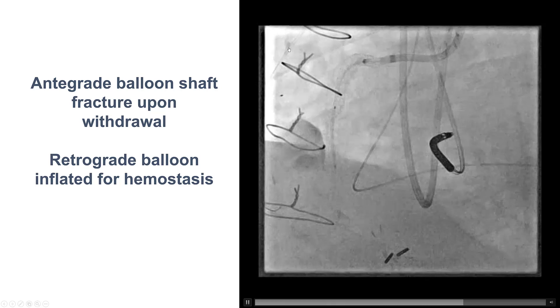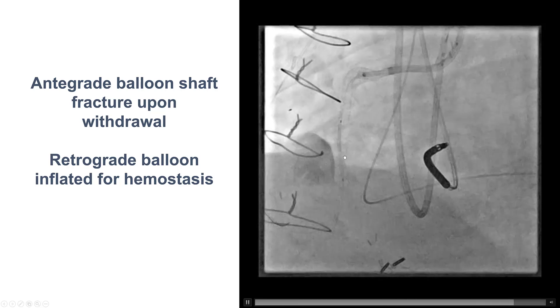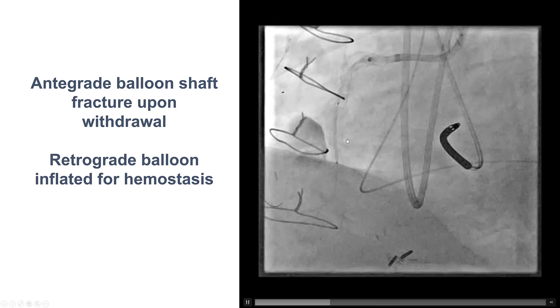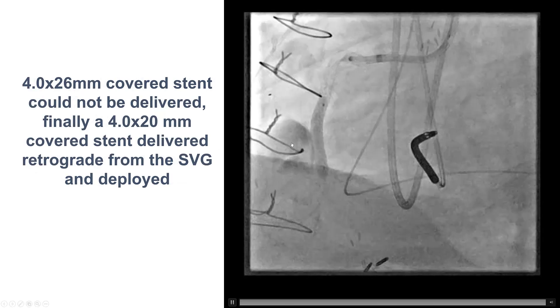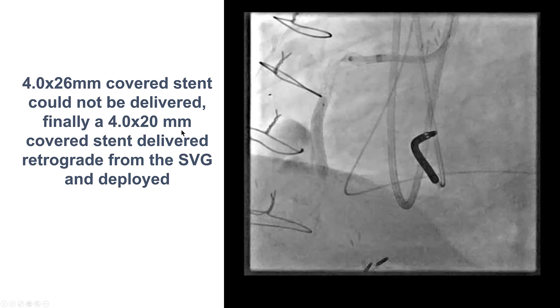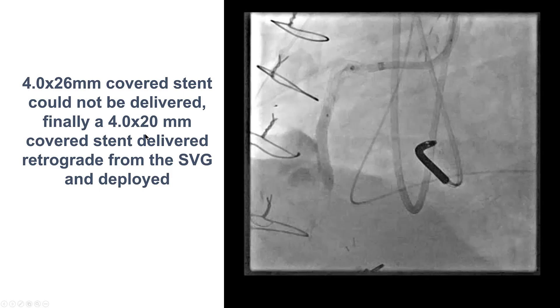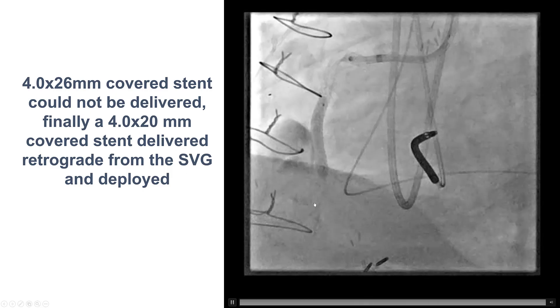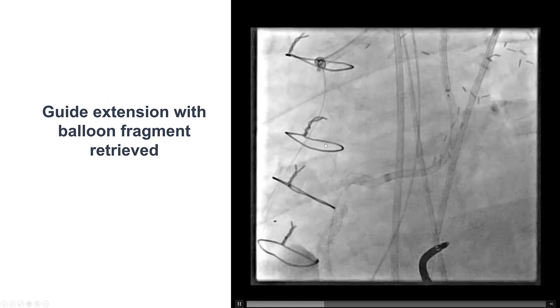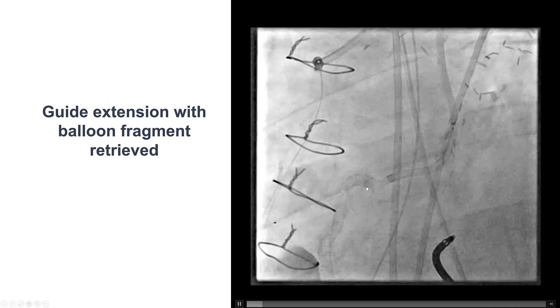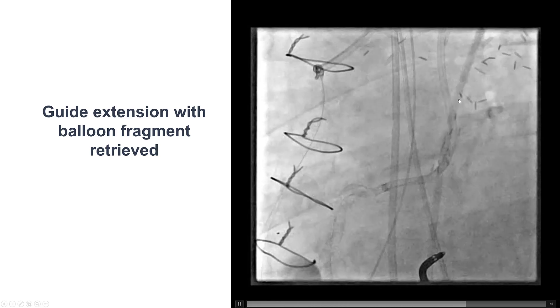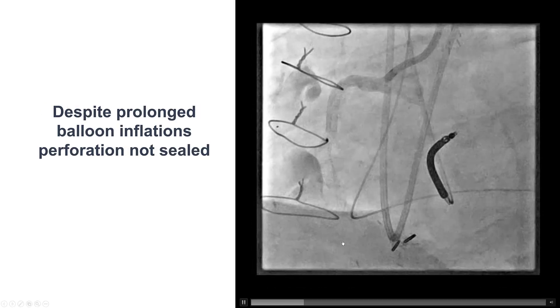But fortunately, here we had retrograde access through a saphenous vein graft, so we were able to use that to insert balloons and then to actually deliver a covered stent. It was a 4x26 Papyrus stent that did not go, but the 4.0 by 20 eventually went and was deployed retrograde into the native right coronary artery. And then, fortunately, we were able to retrieve the fragment of the balloon from the proximal right coronary artery by using a guide extension and withdrawing everything back.